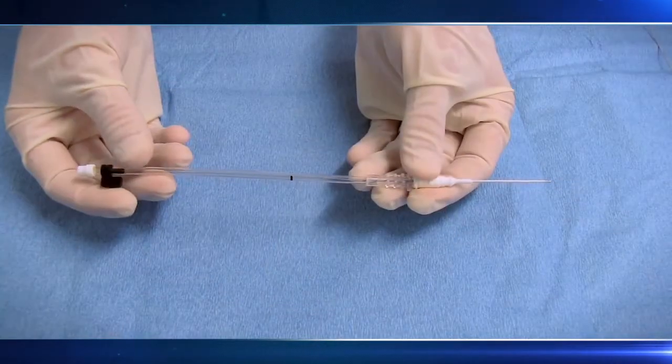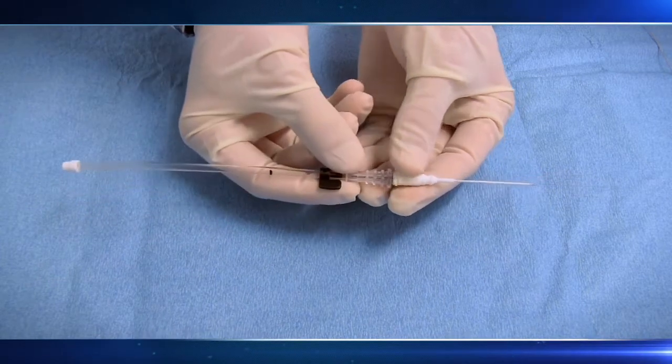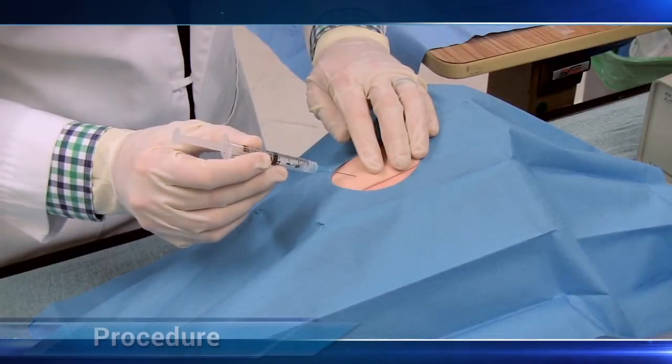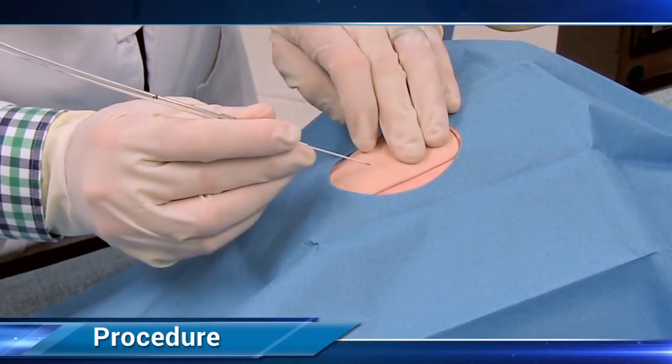We will first demonstrate radial artery catheterization with the modified Seldinger technique, which uses the catheter over a needle that is guided with the built-in wire. Always use lidocaine in a conscious patient. Point the bevel facing up.